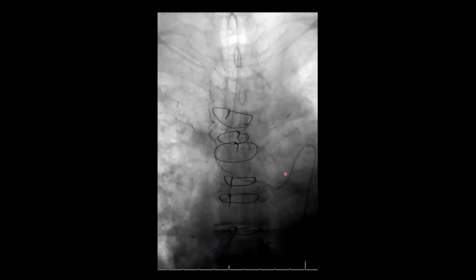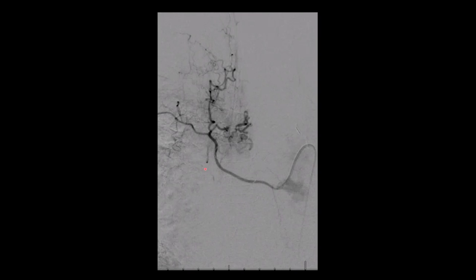This is another example in which this catheter is opacifying an upper thoracic vertebral body, and you see how there is early filling of this spinal cord vein around the spinal cord, which we can see very well also in the Dyna CT, like in this image. So these abnormal vessels are an abnormal, increased pressurized spinal cord vein. How to treat a spinal cord dural arteriovenous fistula?